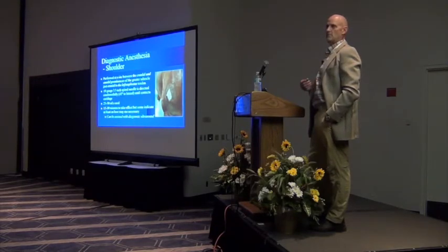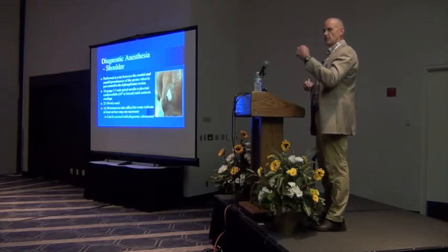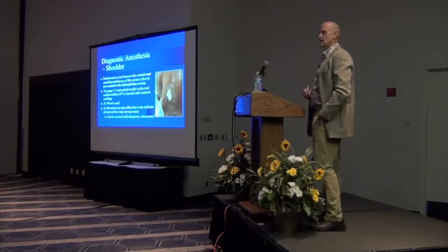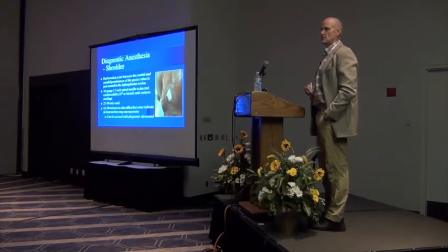If you don't get fluid back, I think you need to, at least after you've driven the needle in there, then you can stick the probe on there if in fact you don't want to guide your injection. But just make sure that you're in the joint, because I can guarantee you they'll flow quite nicely, not in the joint. And there was a study done by a rheumatologist.